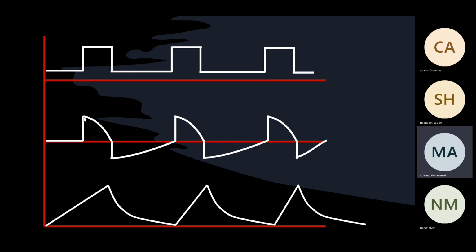So we agree on the pressure. What's going on? Resistance in the flow. I think it's PC. So in the one that we saw, it was like this, is that right? That's right, but it's very minor changes. This patient, maybe he's paralyzed and the machine does everything for him. The volume for these three breaths is the same. It doesn't have to change in pressure control. It's the same mechanics, the same pressure. So the thing is, it's the flow itself.